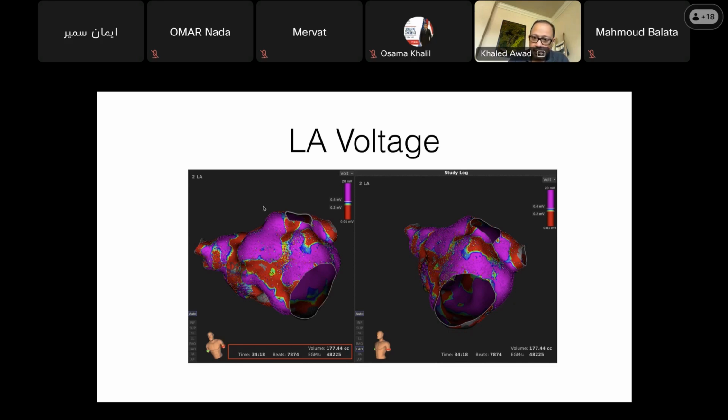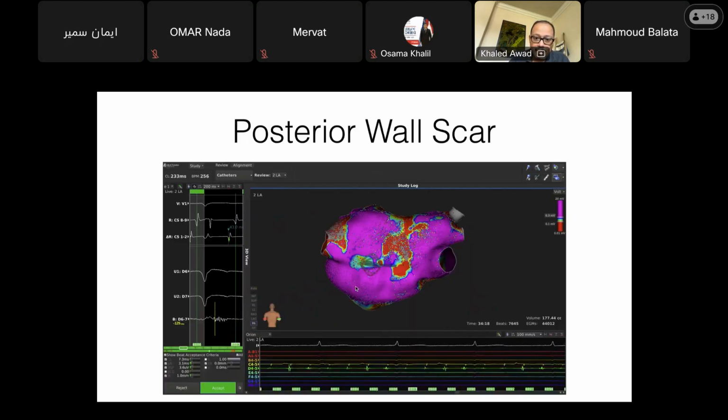Man, I'm getting really upset with myself now because I forgot to get this. And there was also scar below the left inferior pulmonary vein, right here, in this area. The patient had a lot of mitral regurgitation, and an MR jet sometimes can cause scar here. I see this not infrequently, in those patients a lot. And so you can't leave large parts of scar unaddressed.